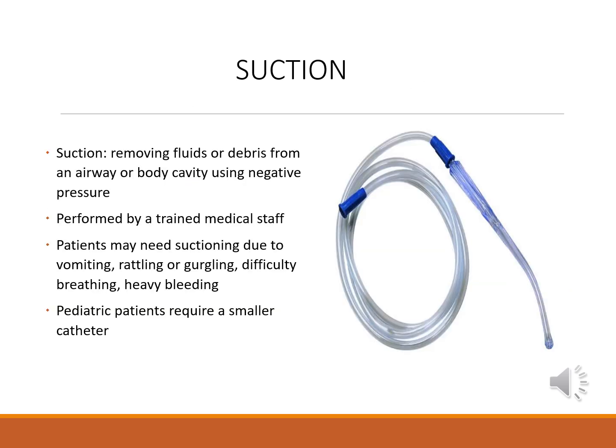Suction is the process of removing fluids or debris from an airway or body cavity using negative pressure. Suctioning should be performed by a physician or a registered nurse. As radiographers, we are not trained to handle suction equipment. Certain conditions may make suctioning risky, such as head or facial injuries, bleeding, esophageal varices, nasal deformities, and severe respiratory conditions. Radiographers should identify when suctioning is needed, alert the appropriate medical staff, and assist with the procedure if required.